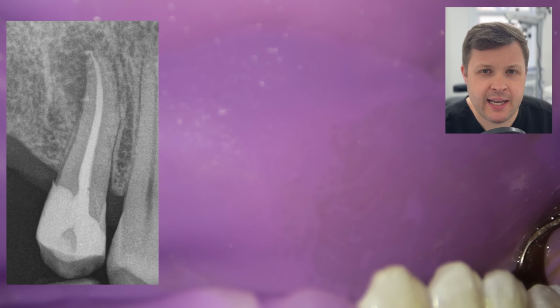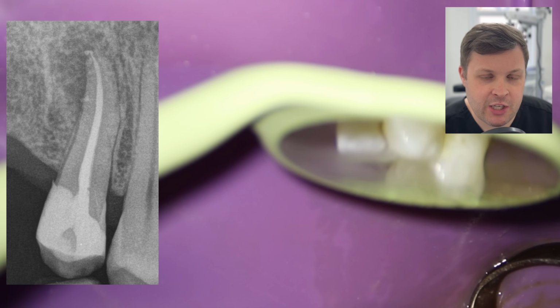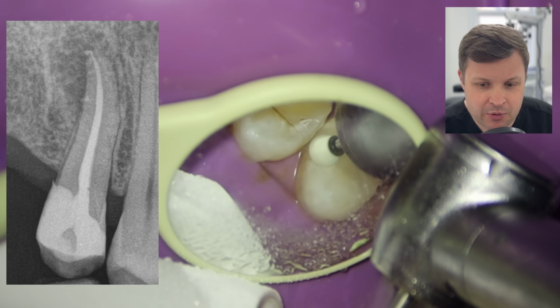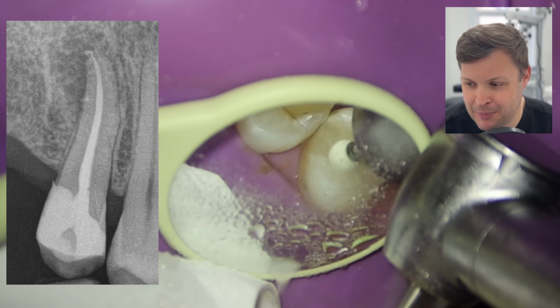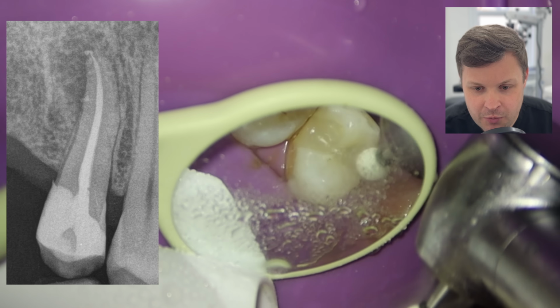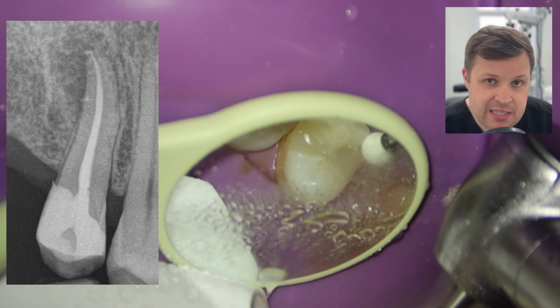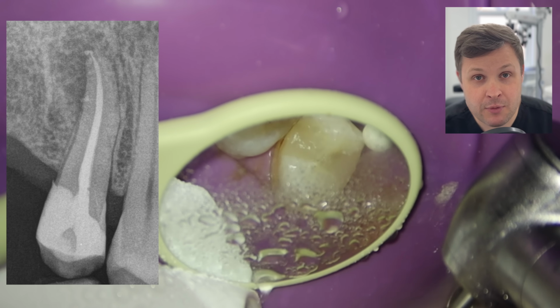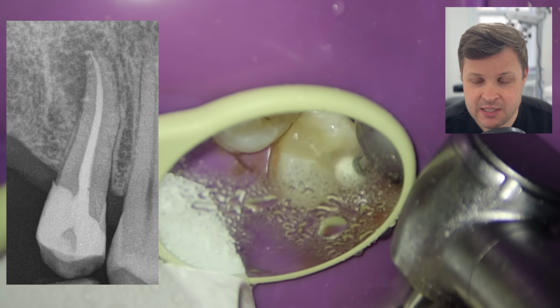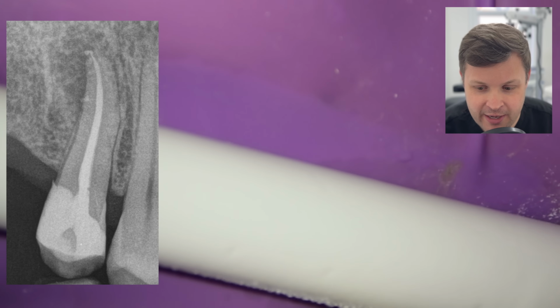We spend lots of time on a root canal, and then when we get our post-op radiograph, this is what it's all about. This makes you want to come to work in the morning. Nothing worse than getting a post-op radiograph and it looks terrible. And overall, we just give it a little bit of a polish. The patient was super happy. There's an argument to say, does this tooth need a crown? I'm not entirely sure. I'm going to leave that to the referring dentist and the conversation he's going to have with the patient. And overall, everything looks great.